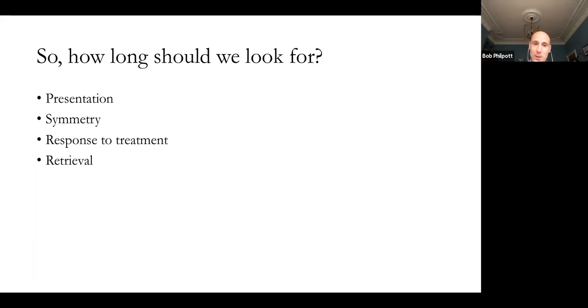just so you could see a little bit better, but I wouldn't do that in a tooth, although I don't believe it would cause an air emphysema. I just am sufficiently freaked out not to do it. Because I think the chances of that happening are probably low, but it's still a chance that it could. So for me, how long would I look for it? Depends on the presentation from the patient.